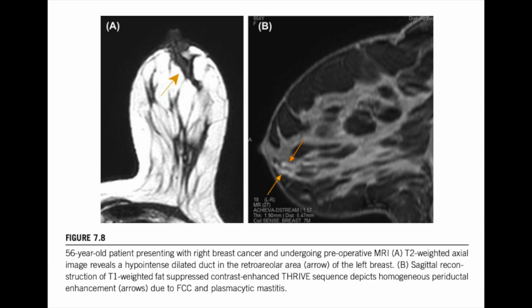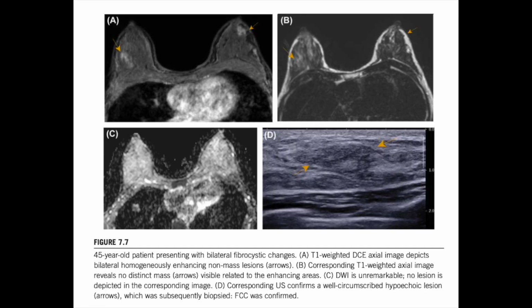So this whole deep dive has really shown that while there are core rules for benignity, round, smooth, persistent kinetics, high ADC, Right. The exceptions are. They're frequent and they're dangerous. You have benign things like adenosis that look aggressive, and then malignant things like mucinous carcinoma that look totally benign. Absolutely. The clinical reality is we are constantly wrestling with these subjective visual calls. Is that spiculated or just irregular? Is that plateau curve just high enough to be a worry? It's a multi-factor decision based on imperfect data.